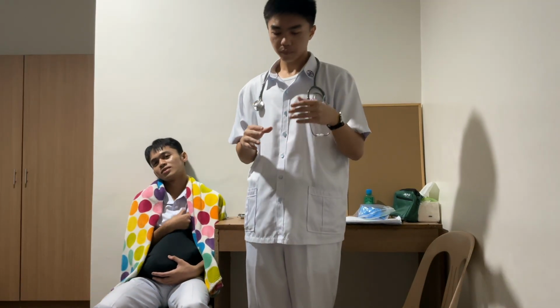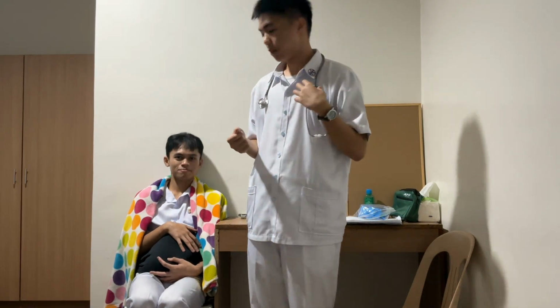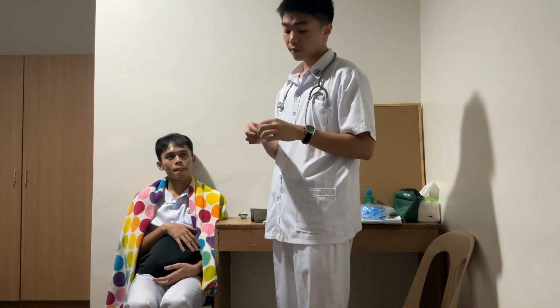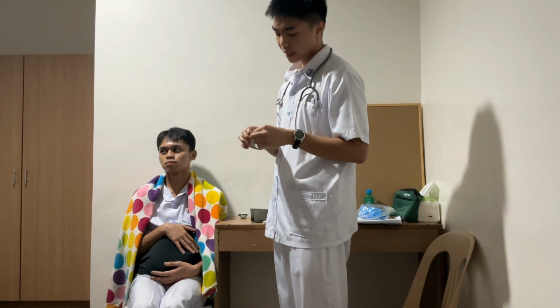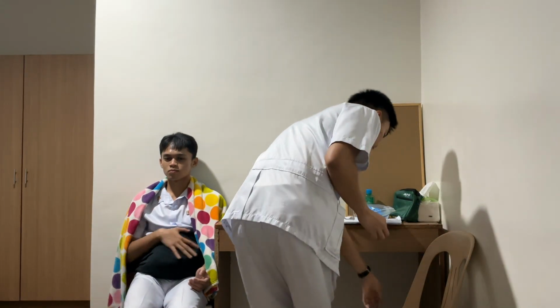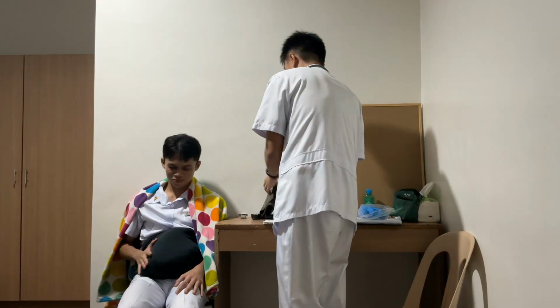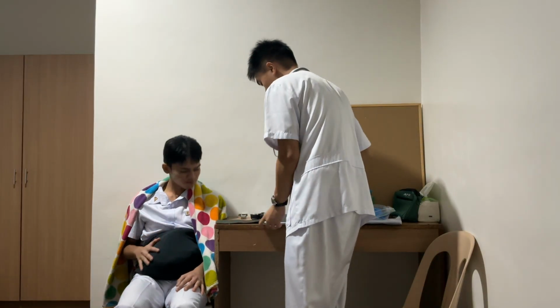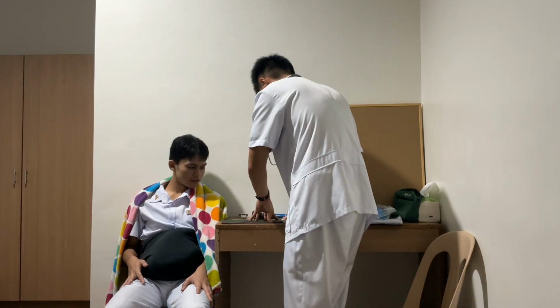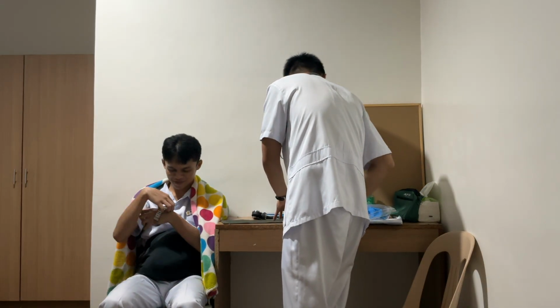Okay, so I've already removed the cuff and that is already done. And then once that's done, just like the thermometer, we can take an alcohol swab and disinfect the cuff, ready to be used for the next patient. You can go ahead. Yes, go ahead. Thank you po. Thank you for your cooperation.